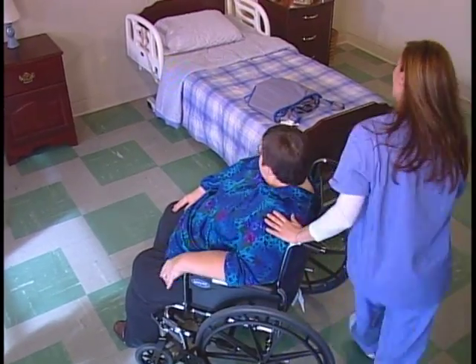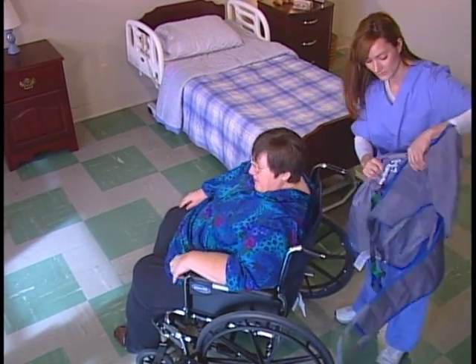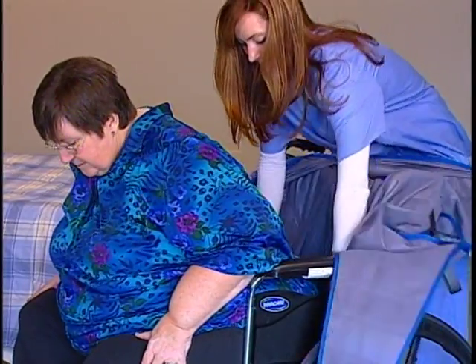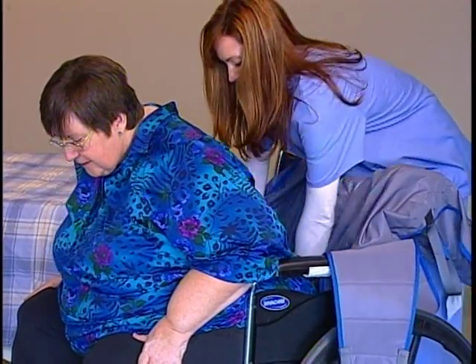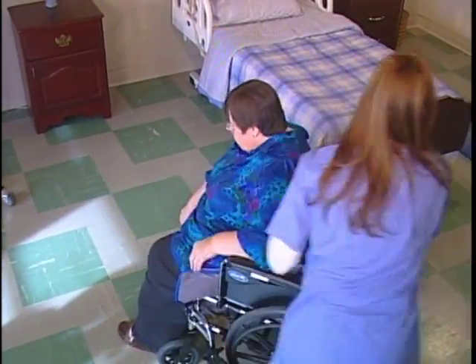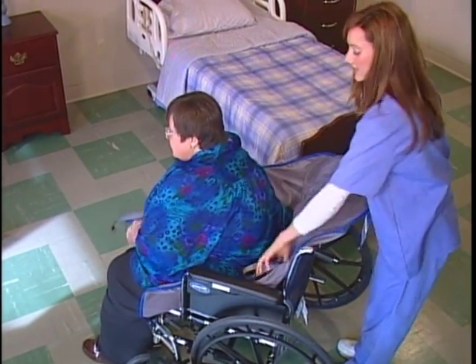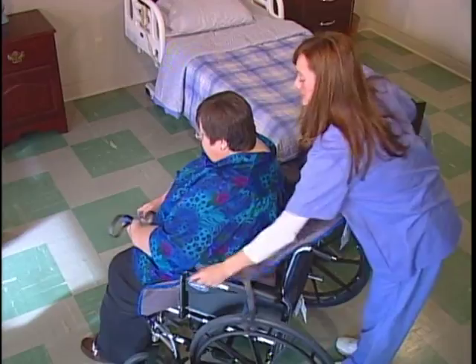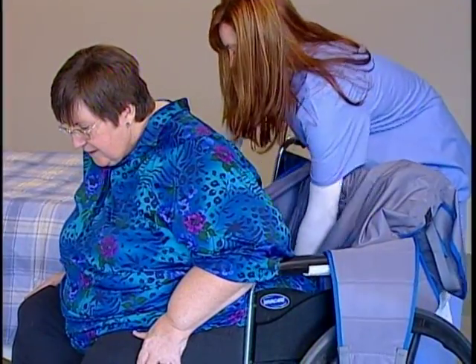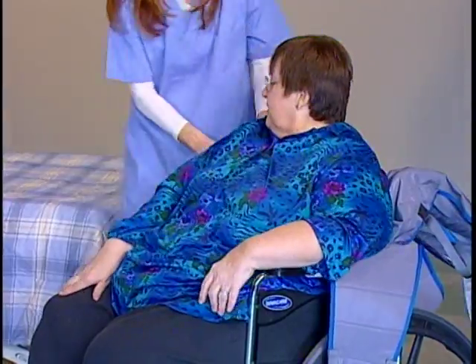Position the sling on the resident. Have the resident lean forward in the chair. Take the sling and slide it behind the resident with the smooth surface against the resident's body and the grab handles outside. The sling should be positioned between the top of the resident's head and the base of the spine. Make sure it's straight and parallel to the resident's shoulders. Push the bottom of the sling down to the seat.